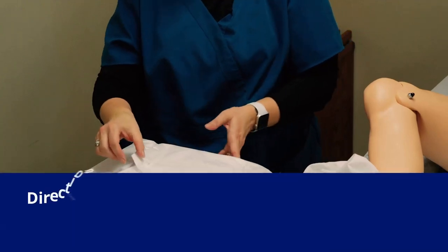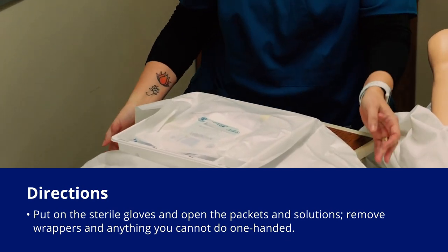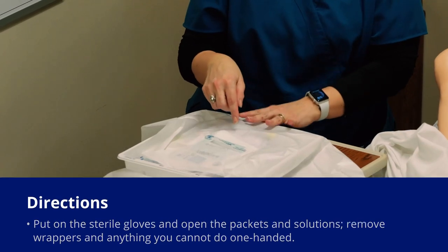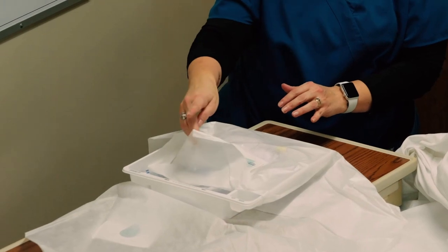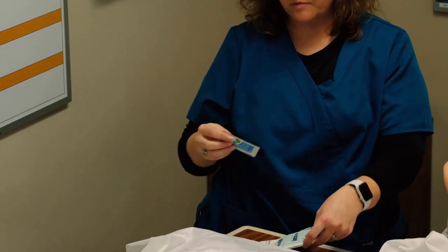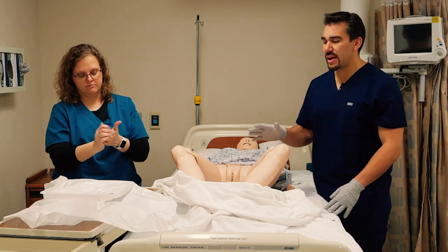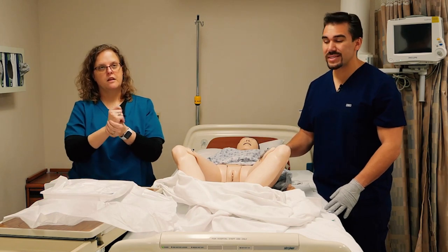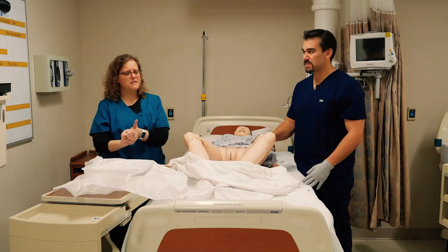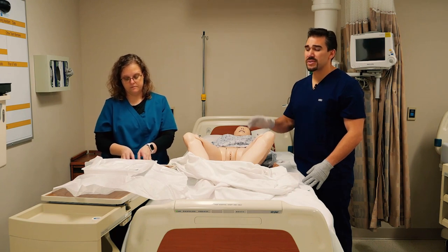I'm going to open this kit — the outside edges are things you can touch; the inside edges aren't. Every kit could be packaged a little differently. Here they've put the gloves on this side, and there's that hand sanitizer with the gloves. One thing is always — especially in nursing school — always have an extra pair of sterile gloves, because you never know when you're going to break sterile field, especially for a Foley catheter. If you've got somebody helping you, they should have a pair of sterile gloves too. You can always put them back if you don't use them.